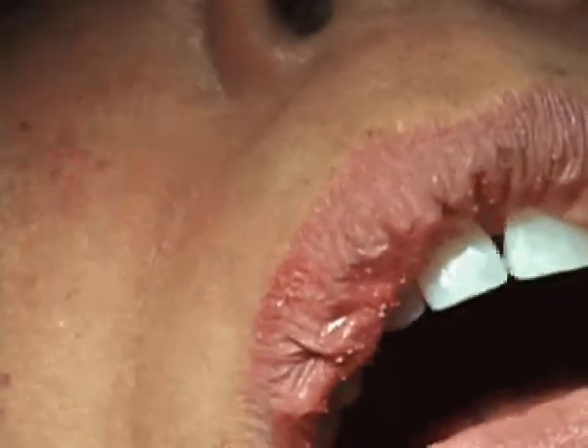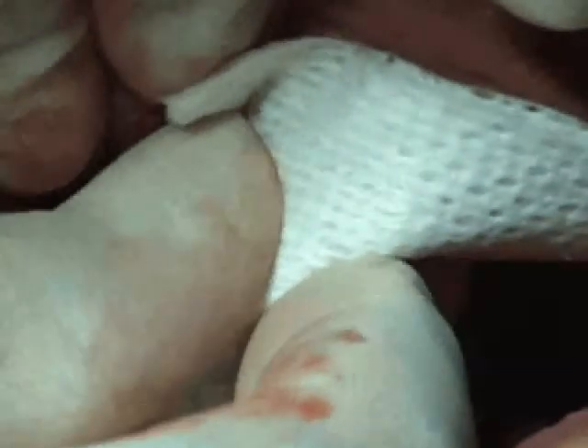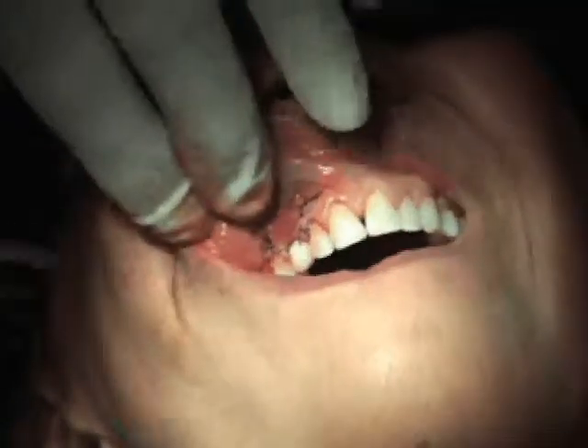Now that completes the suturing. We're going to compress that a little bit by putting a gauze and putting pressure between my fingers to compress the graft between the teeth. And we're just going to wash off any excess.